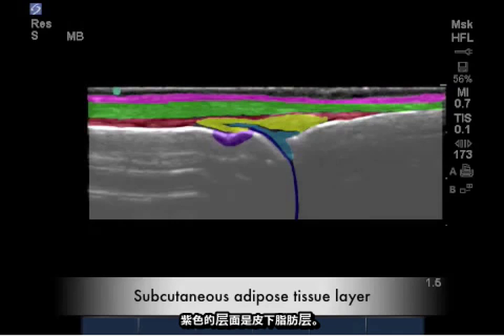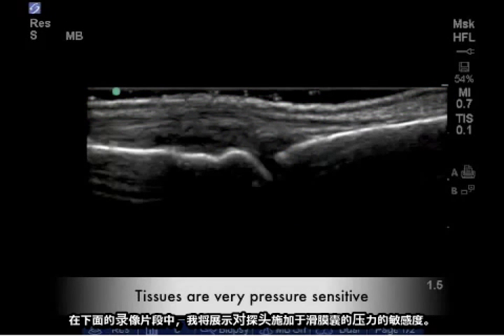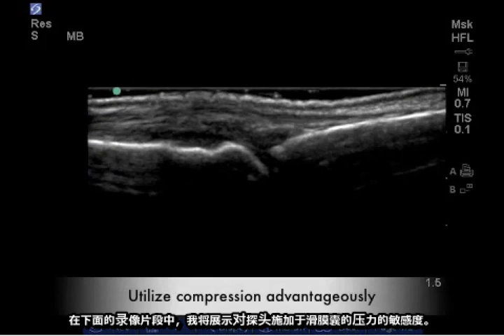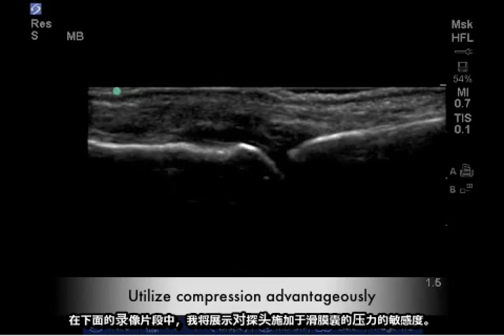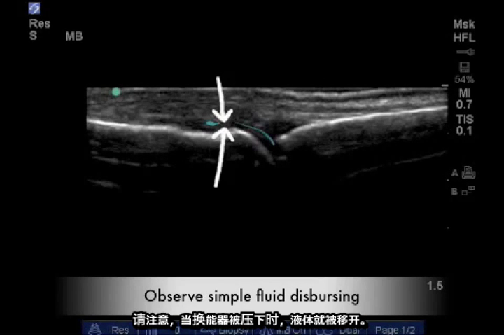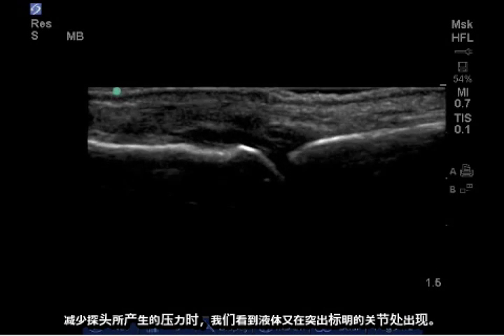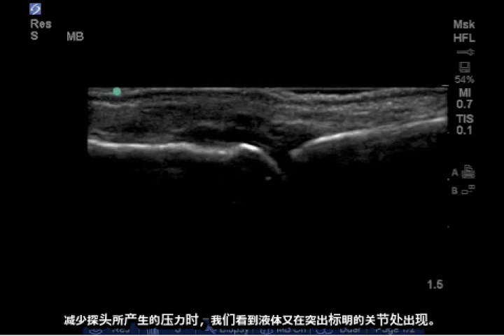The purple layer is simply a subcutaneous fat layer, followed by the orange layer which is the actual cutaneous layer or skin. In this video clip I will demonstrate the sensitivity to probe pressure on the synovial capsule. Observe the simple fluid displacing while the transducer is depressed. Upon letting up on the probe pressure, we see the simple fluid emerging from the joint.